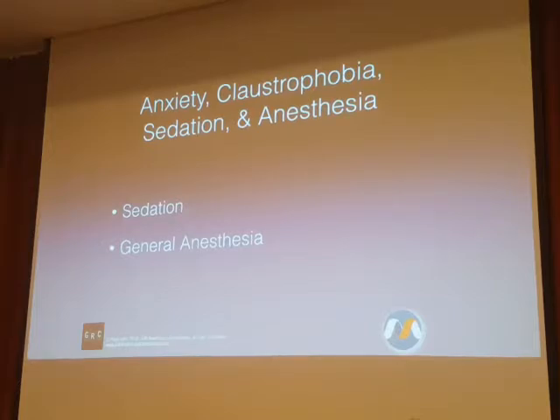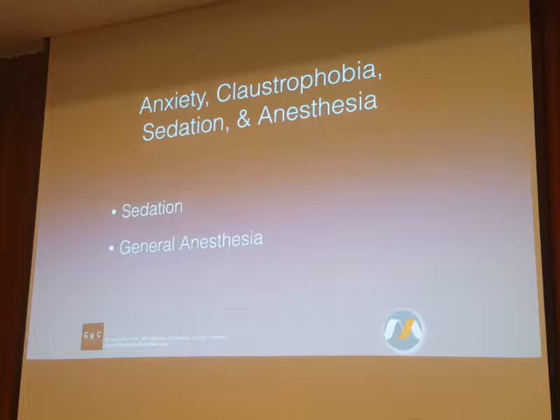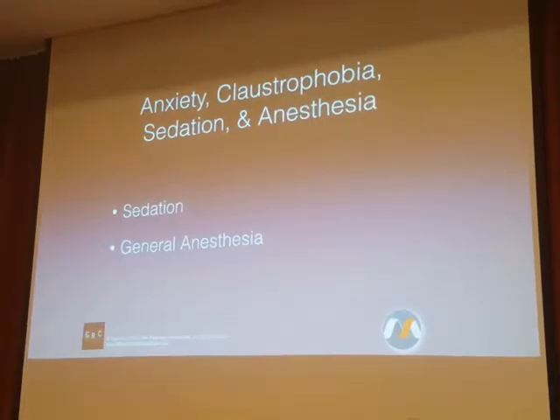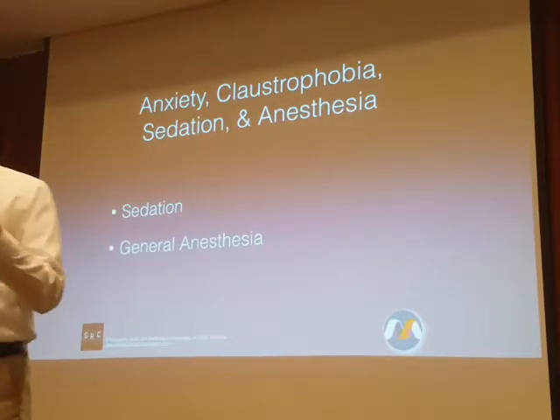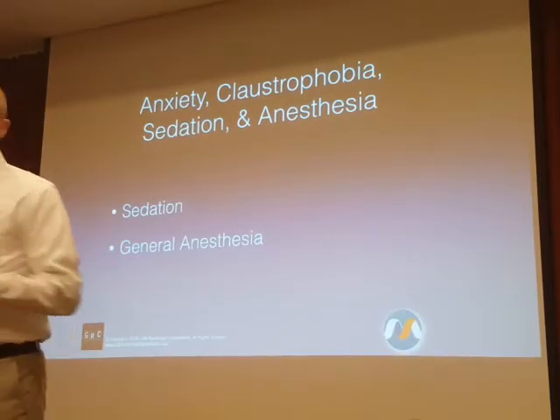I'm not going to tell you how to do your job. I am going to tell you that if you come into the MR suite, everything you bring needs to be MR conditional, so that I know that whatever you need to do to take care of that patient, I don't have to worry about that. And as long as those ground rules have been laid in advance, then there really should be no conflict between anesthesia and radiology in terms of the care of the patient in the MR environment.